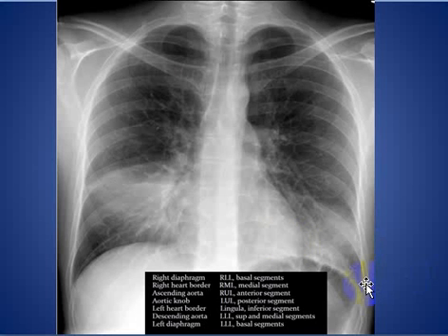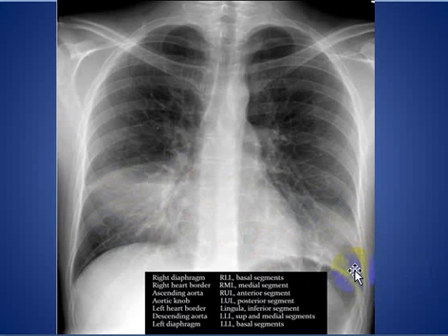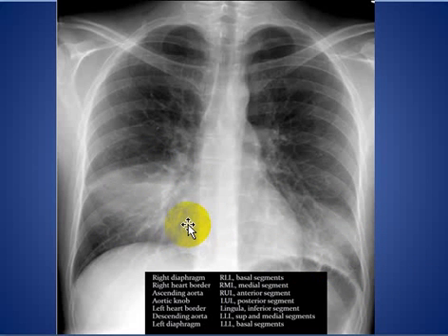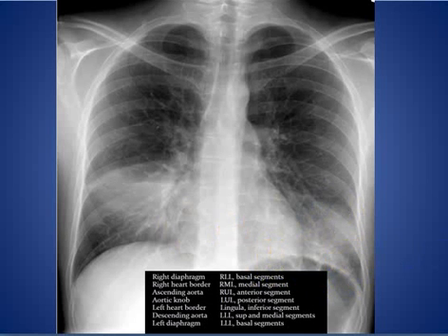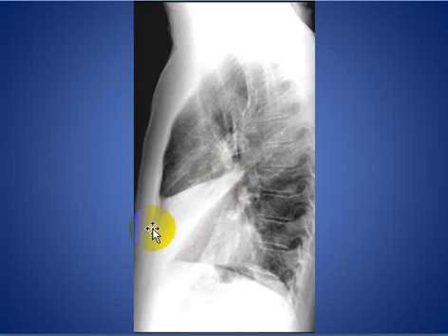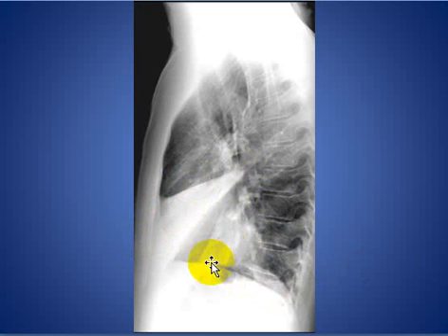Here is a nice example with two opacities. One is obliterating the right cardiac border, and the other is partially obliterating the left hemidiaphragm without obliterating the left cardiac border. The opacity obliterating the right cardiac border is located in the middle lobe medial segment. The opacity obliterating the left hemidiaphragm is located in the basal segment of the left lower lobe, as confirmed on the lateral chest X-ray.